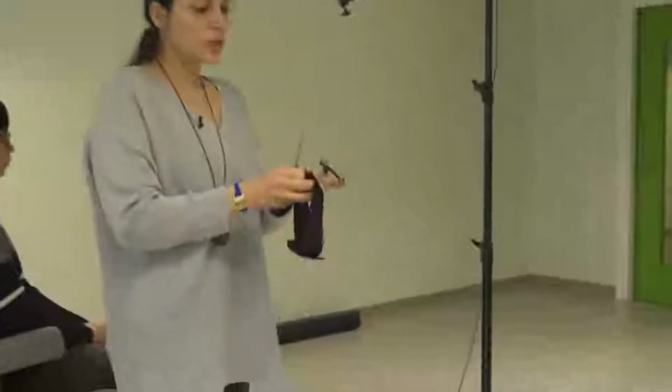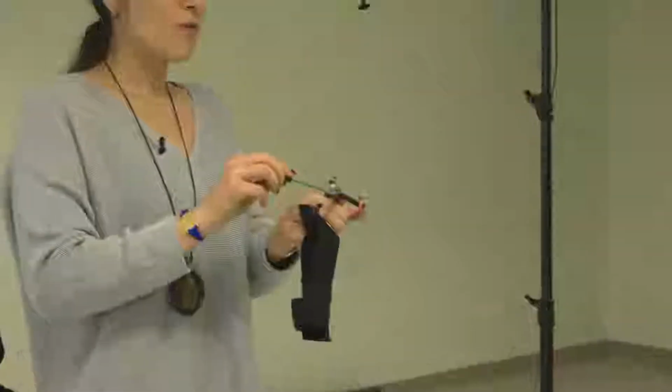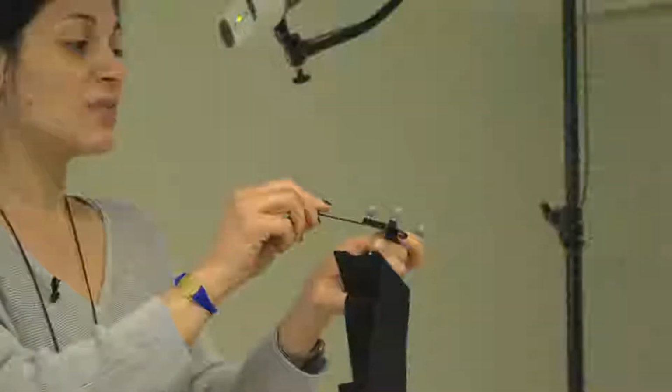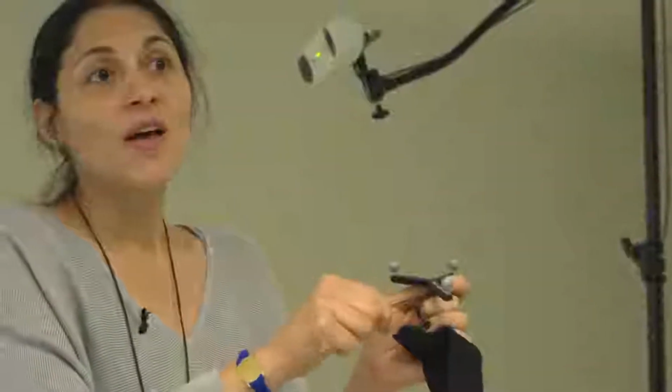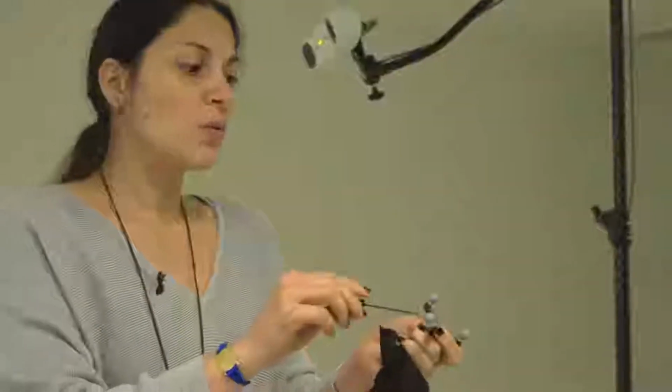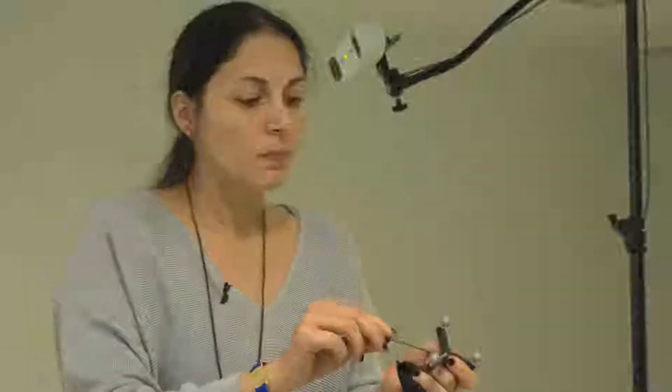When you are going to do your experiment, you need to come half an hour before and organize all this stuff. It might take half an hour until I have this ready. It's a silly thing, but it's hands-on. And here you are seeing what you have to do in your real experiment. Don't wait until 5 minutes before, or you will not have your experiment ready, and it will take an awful amount of time.